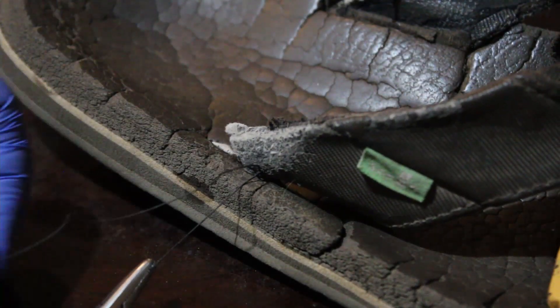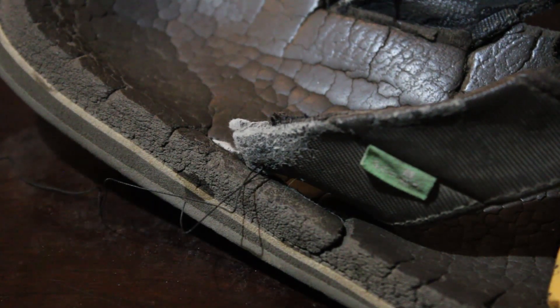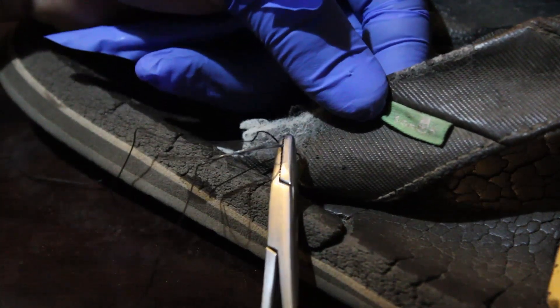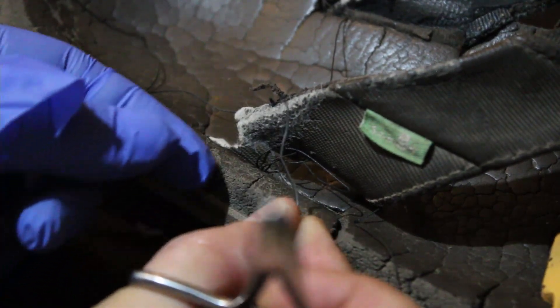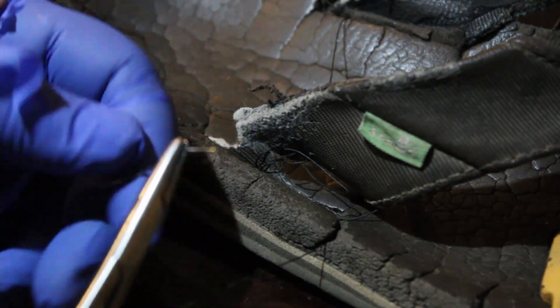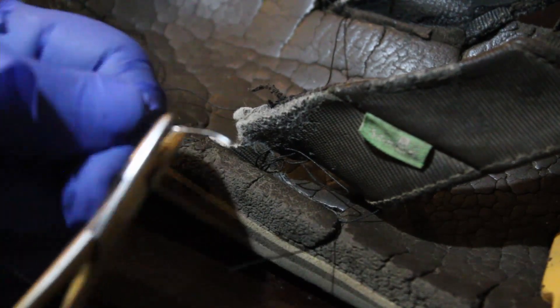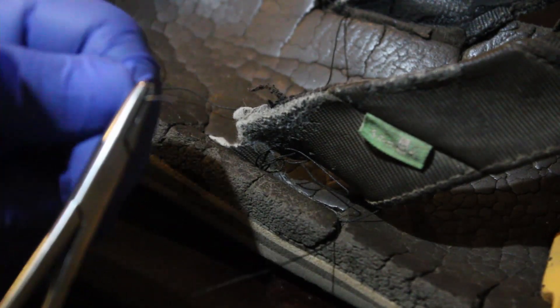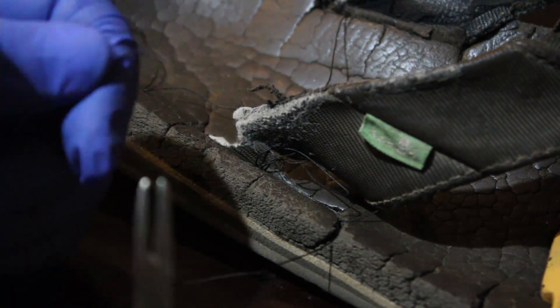Now grab your needle again and keep applying the stitches. It doesn't matter if you bend the needle a little bit — you can always bring it back to shape just by applying a little bit of pressure with your tweezers.